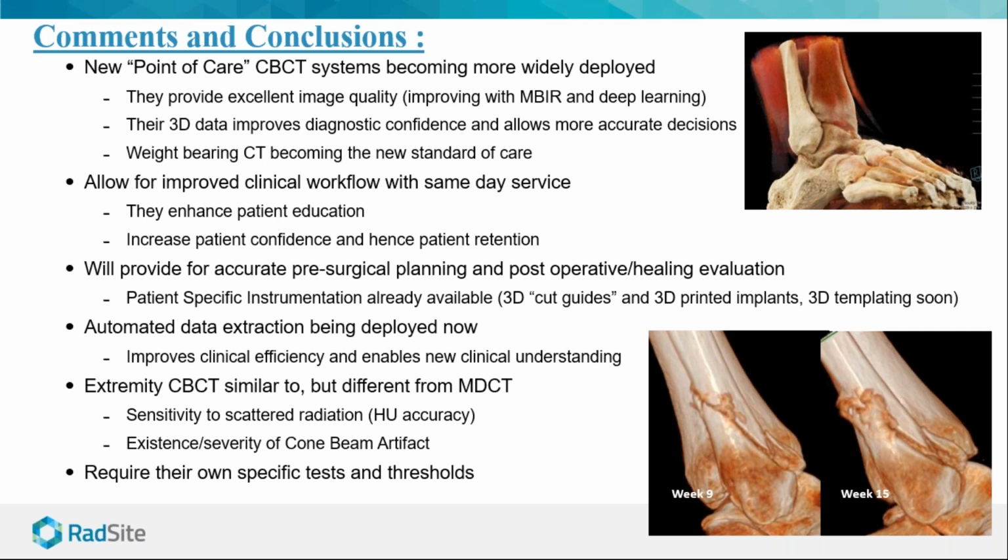One of the big advancements is going to be the automatic data extraction of information around, for example, making measurements in the foot and ankle when someone stands on their ankle. How far do the different bones move from each other and how far do they rotate? This is a whole new area of clinically relevant information that the surgeons and radiologists are going to have at their fingertips, and they're only just starting to understand the clinical significance of that new capability.